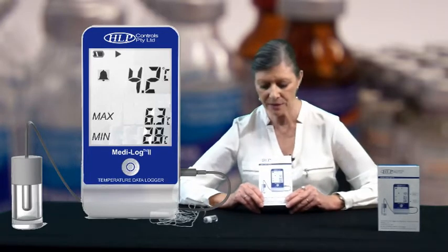Hi, my name is Liz from HLP Controls and this unit is the MediLog2. This unit has been produced, designed, developed, and is also manufactured by us, HLP Controls. This is a vaccine storage data logger and it meets all the requirements of the health department. It's perfect for food storage as well, so you can use it for storing anything you need to data log the storage temperatures.